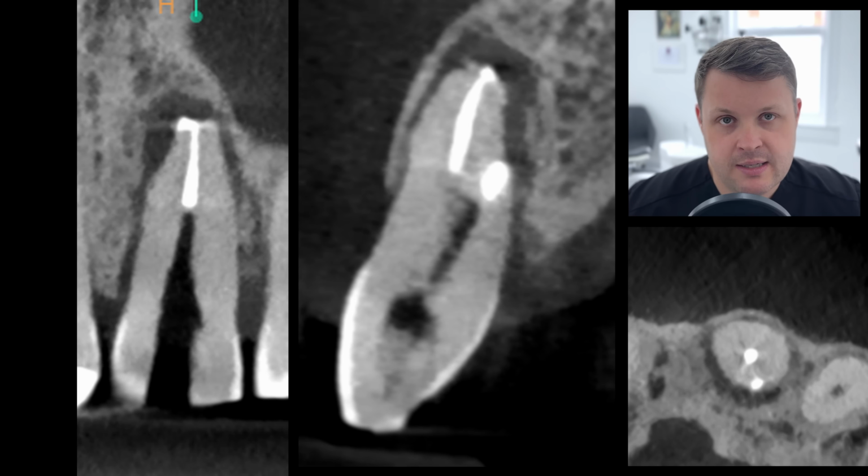Luckily, in this case, I've managed to repair the perforation. You know, there's an argument to say that I have removed tooth tissue, but I think in this case it's not a significant amount of tooth tissue. I'm quite happy with that, and we filled the apical end here very, very nicely, and overall I think it's a really, really nice result.